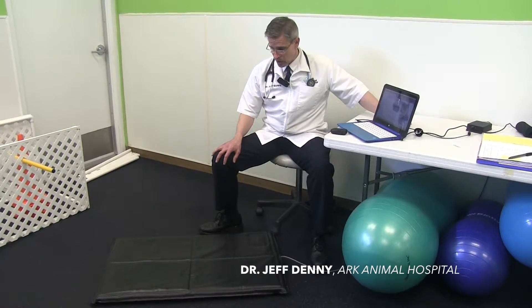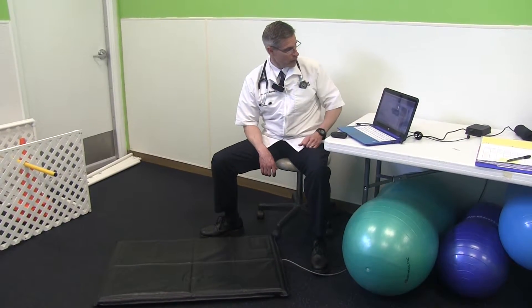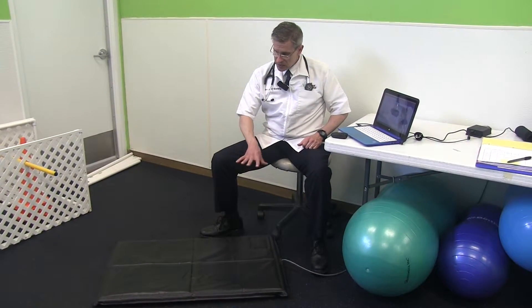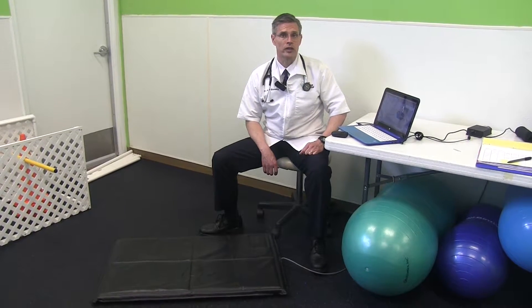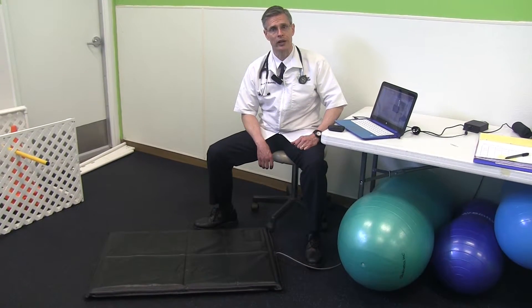Here I'd like to talk about our Stance Analyzer from Companion Animal Health. This has been a tool for us to use in our upstart rehabilitation program that we're starting here at Arc Animal Hospital.